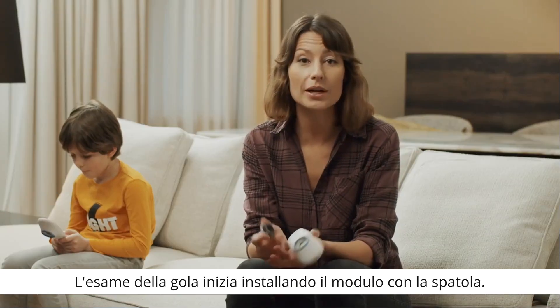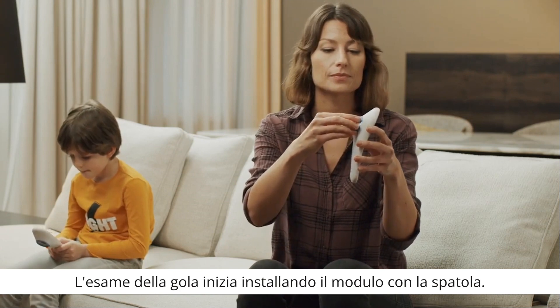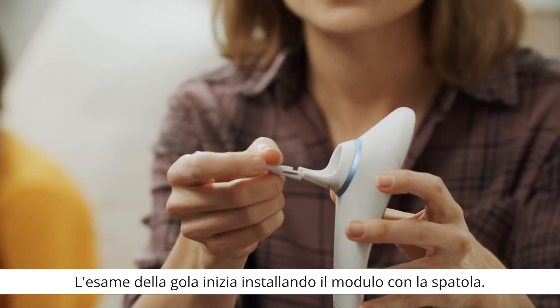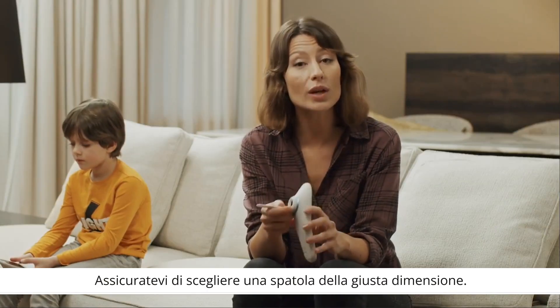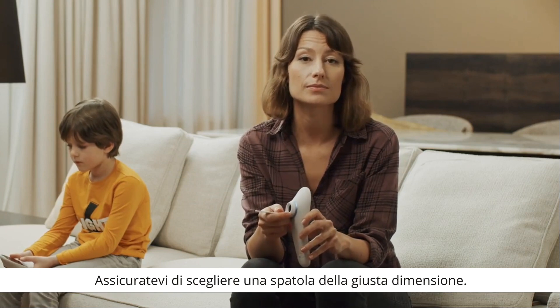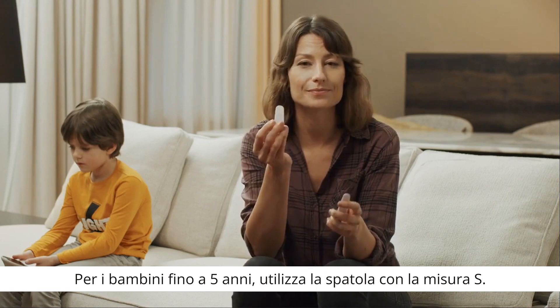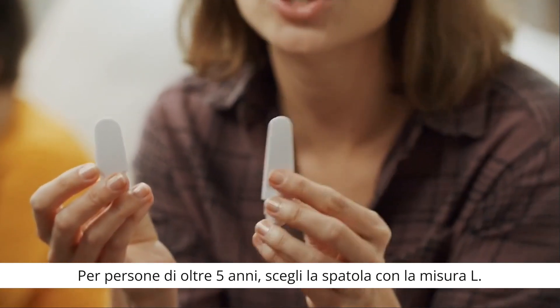Start the throat exam by attaching the module with the spatula. Make sure to choose the right size of the spatula. For children up to 5 years old, use a size S spatula. And for anyone over 5 years old, a size L spatula.